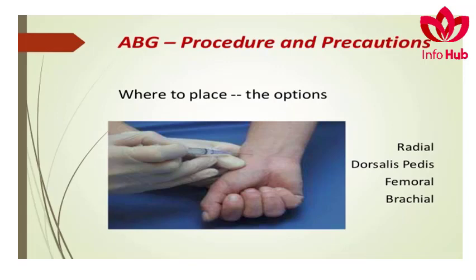The physician is attempting a radial tap. The radial artery is localized by first palpating it, and then with the help of a specialized syringe, you go slightly deeper, because arteries are a bit deeper than veins, and you draw blood for arterial blood gas analysis.